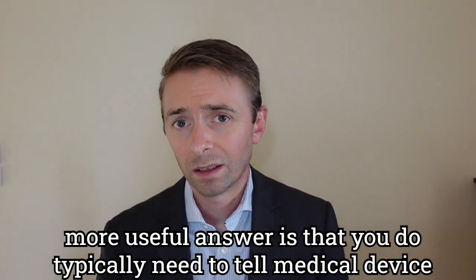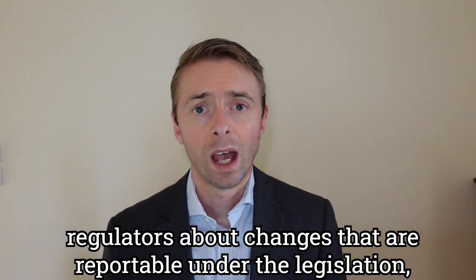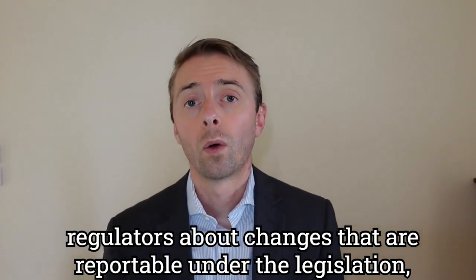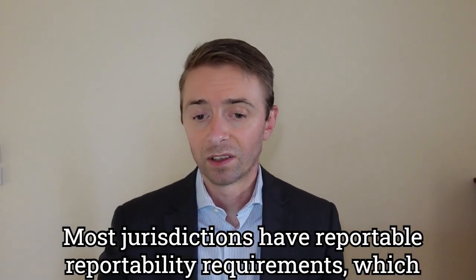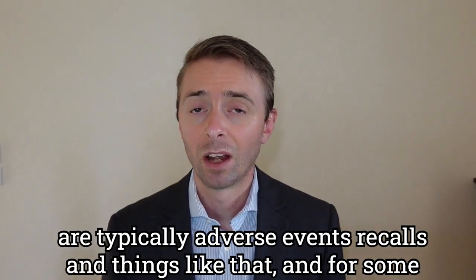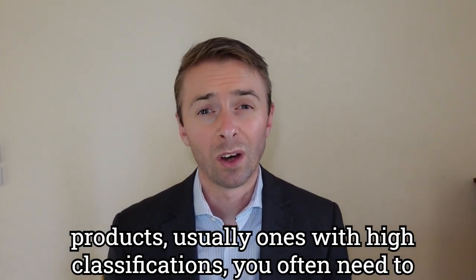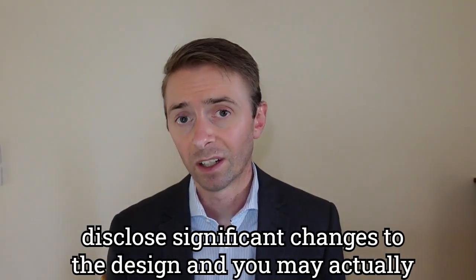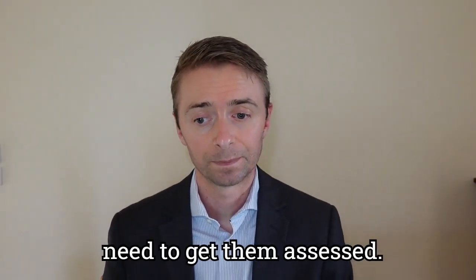A more useful answer is that you do typically need to tell medical device regulators about changes that are reportable under the legislation or have an impact on safety or performance of the product. Most jurisdictions have reportability requirements, which are typically adverse events, recalls, and things like that. And for some products, usually ones with high classifications, you often need to disclose significant changes to the design, and you may actually need to get them assessed.